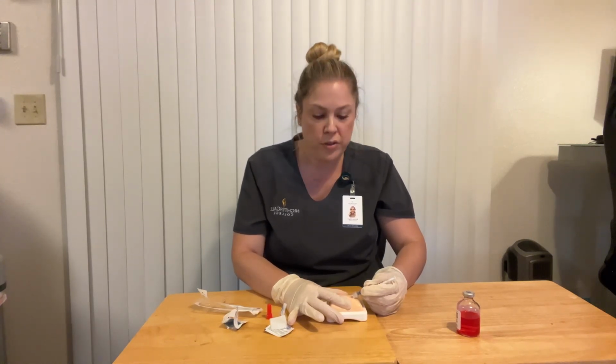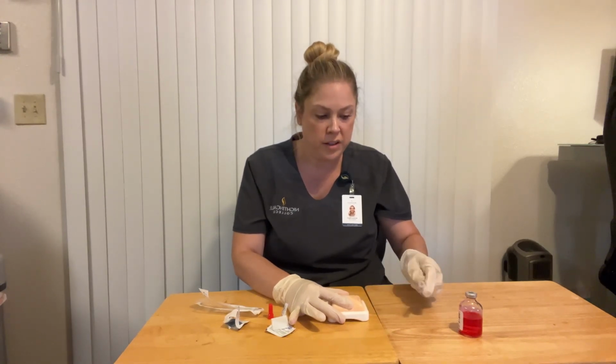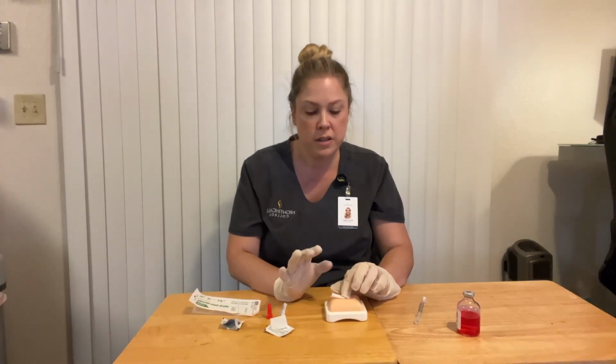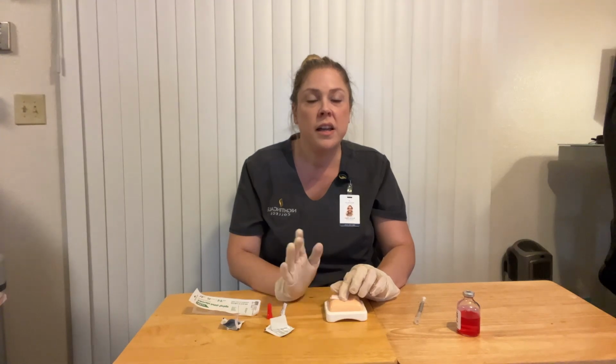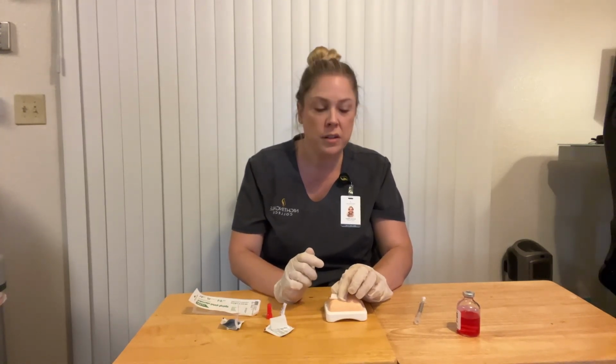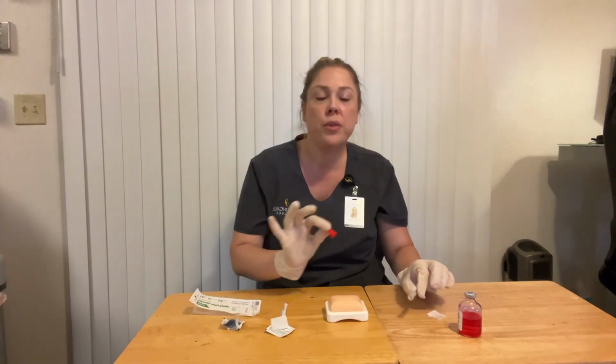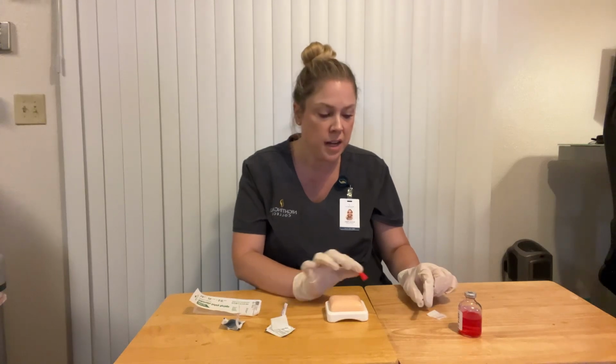We would then withdraw that needle, put the safety cap on, cover it with an alcohol swab, not massaging, just hold it there. If they need a bandage, we would go get one. We would not recap the needle. We would just discard both the cap and the needle into a sharps container at that point.